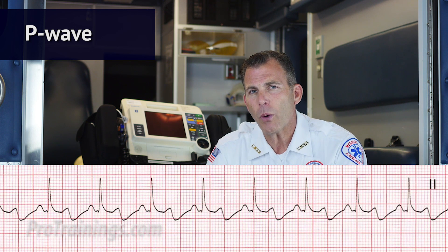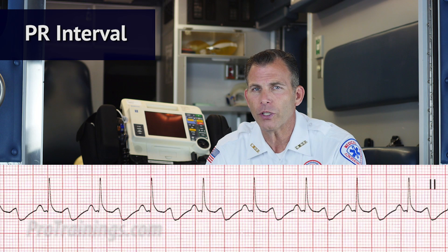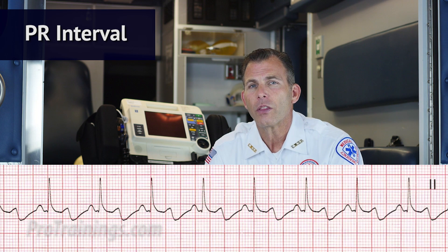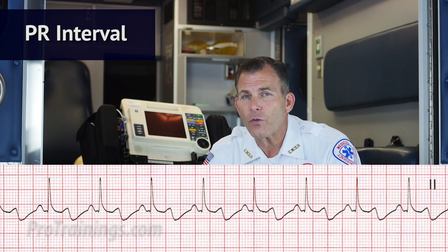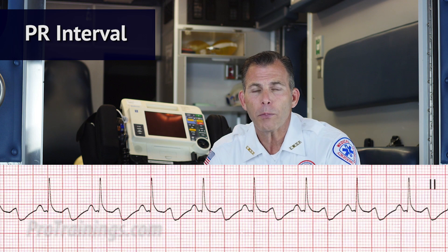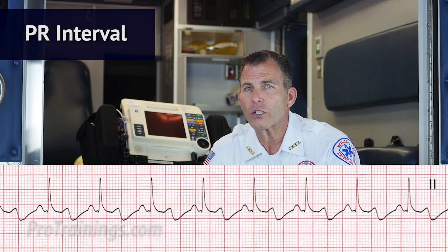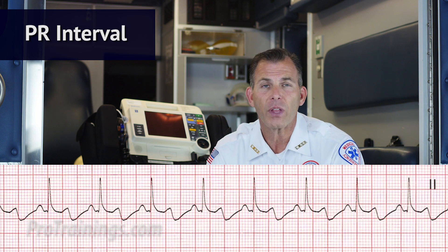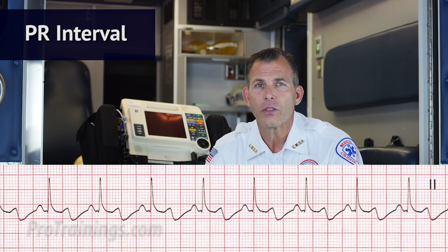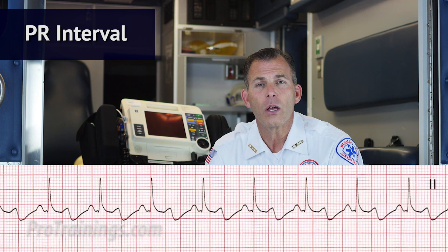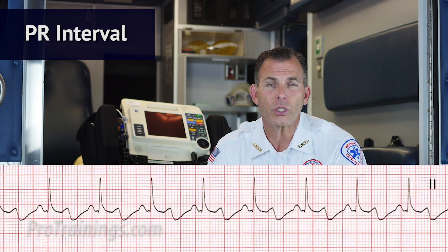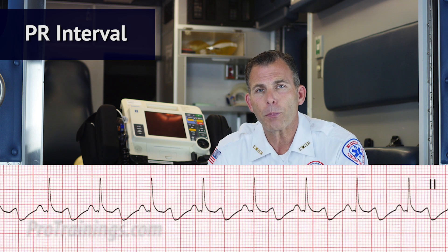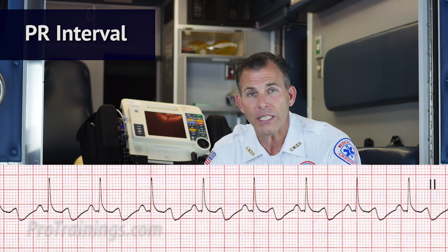So now we want to know what the PR interval is for this ECG. The PR interval falling between the norm of 0.12 to 0.20 seconds is okay. And in this case, yes — the PR interval is contained within one large box, which equals 0.2 seconds. Is the PR interval constant? Yes.